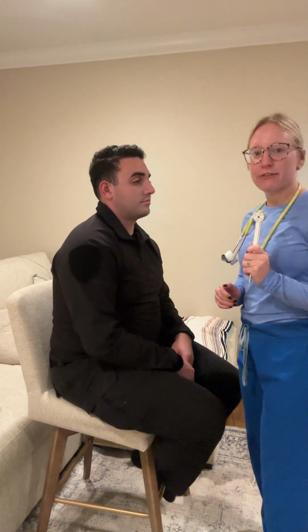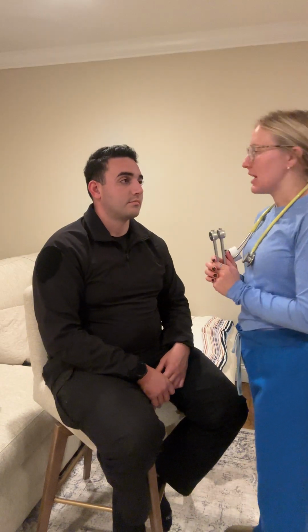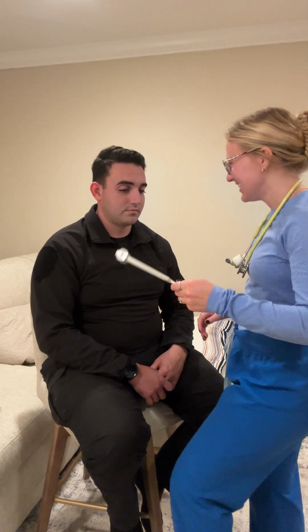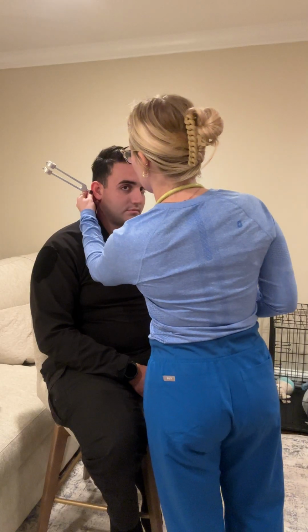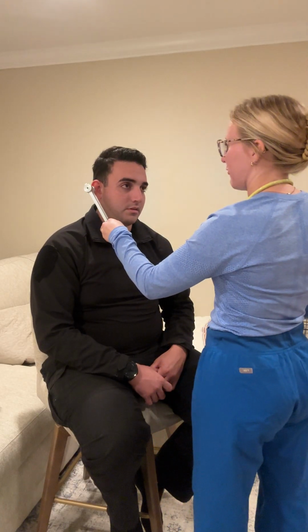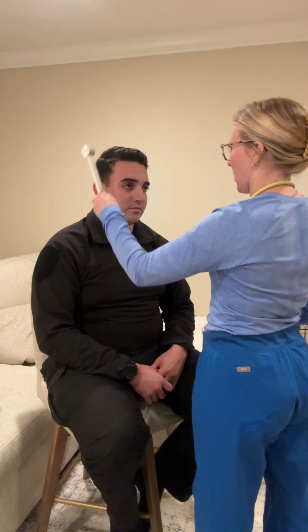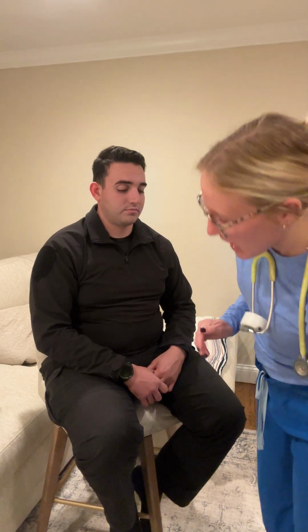So this tests air versus bone conduction, and conductive and sensorineural hearing loss if you have it. So what we're going to do is I'm going to tap this on my leg and it's going to vibrate. And now I'm going to stick it behind your ear on the bone. Do you feel the vibration? I do. Do you still feel and hear the vibration here? I do. Okay. And do you feel the vibration here? I do. Good. So you have passed the Weber and Rinne test.